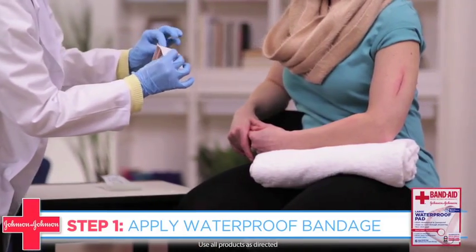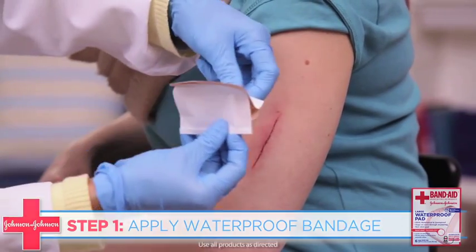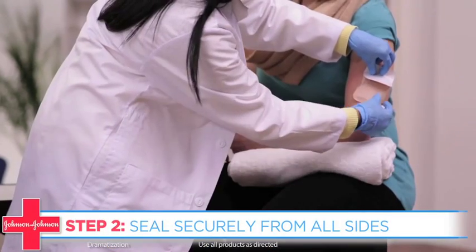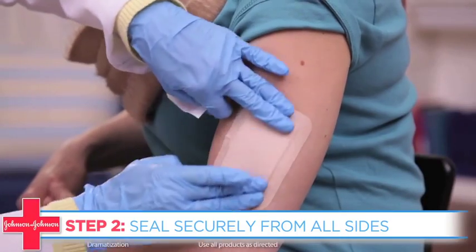Before you get into the shower, apply a waterproof bandage like the Band-Aid brand First Aid Waterproof Pads on your surgical wound. When applying this bandage, make sure that it's sealed from all four sides so no water gets inside and comes in contact with the wound.